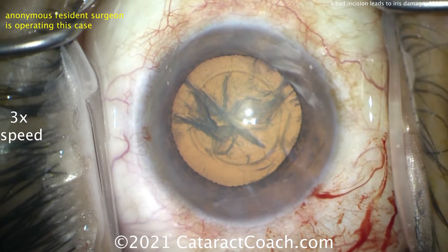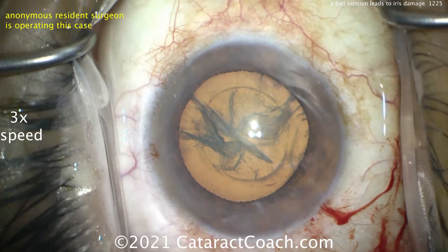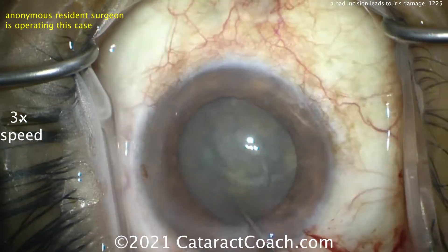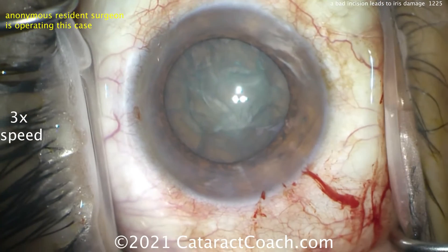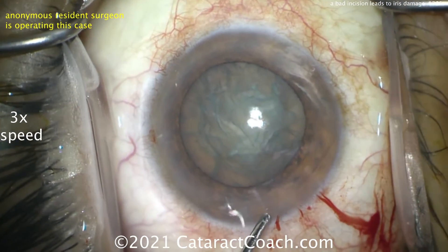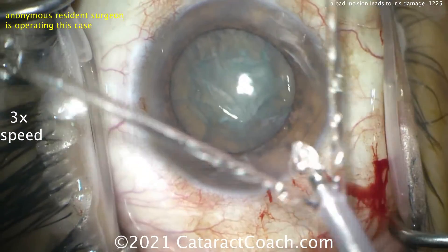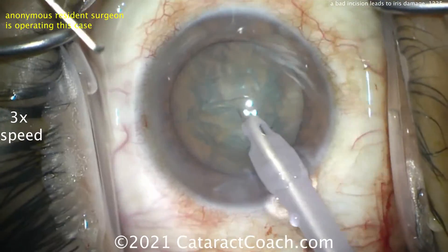In this case there's going to be too much outflow because it's going to leak through that incision. This is a very unfortunate thing. The incision is so important — it sets up the entire case because it determines fluidics, and that's a really important part of surgery: maintaining that balance in such a small anterior chamber. The resident is going to have an anterior chamber that's very unstable; the iris is going to prolapse, it's going to be uncontrolled, and the pupil's going to come down.